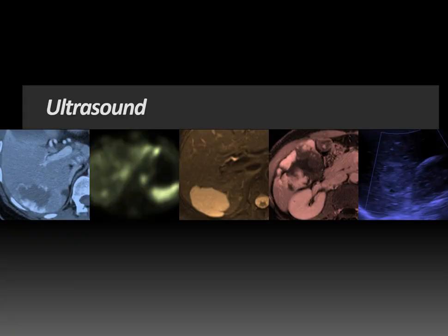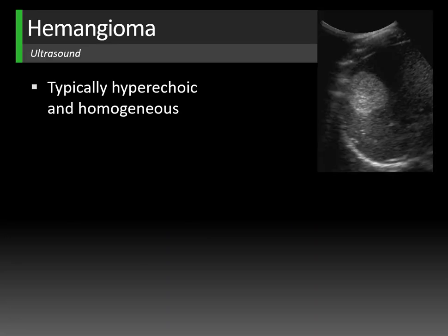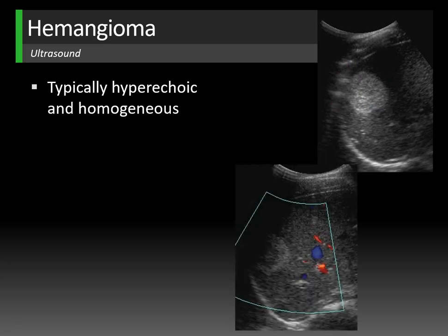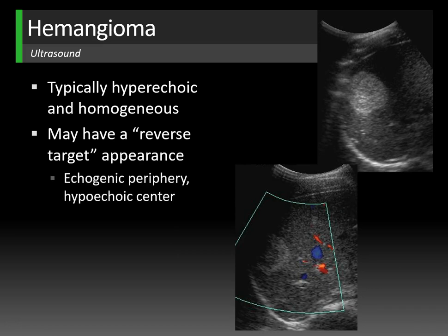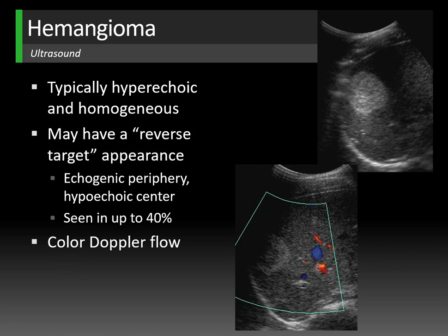On ultrasound, hemangiomas are usually echogenic and homogeneous — a right hepatic hemangioma appearing diffusely homogeneously hyperechoic with slightly lobulated margins. Another pattern, seen in about 40% of hemangiomas, is the reverse target appearance: an echogenic periphery and hypoechoic to isoechoic center. On color Doppler imaging, there's usually no detectable flow since hemangiomas are often avascular on ultrasound.